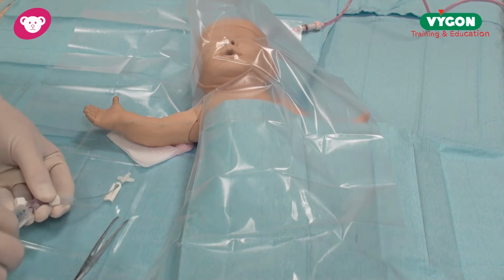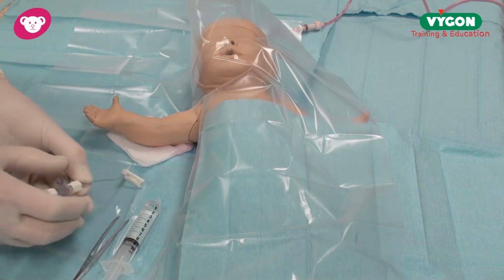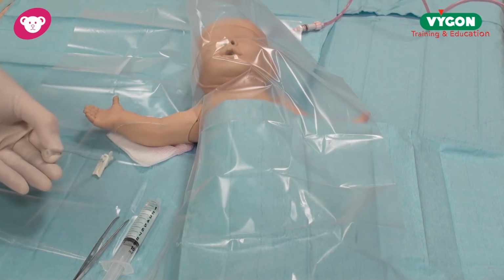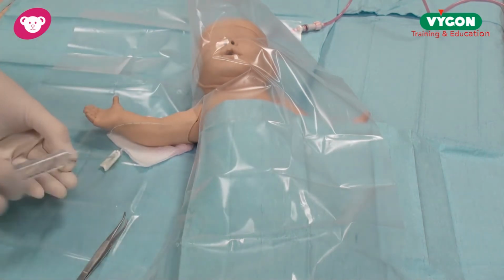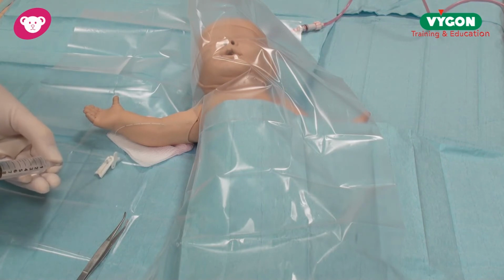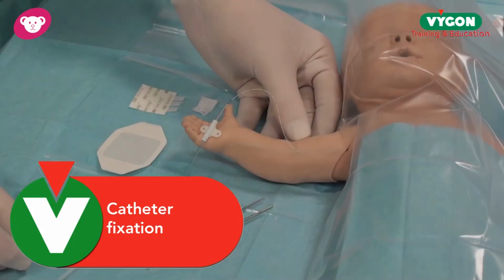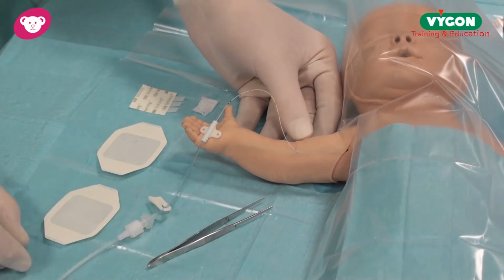Now I'm going to remove the stylet, and the stylet is removed like so. Undo the luer and then bring the stylet very gently out of the baby's catheter, dispose of it, and then reapply, and then push pause, and now we're ready to fix the catheter in place. We have now completed a chest x-ray on the baby, and the tip is in the perfect position.